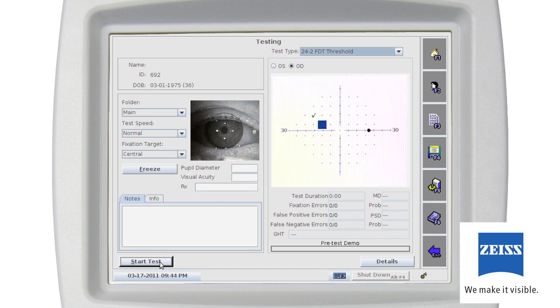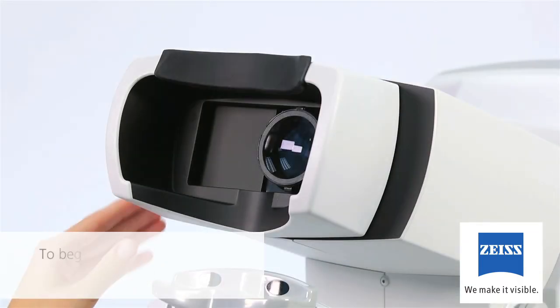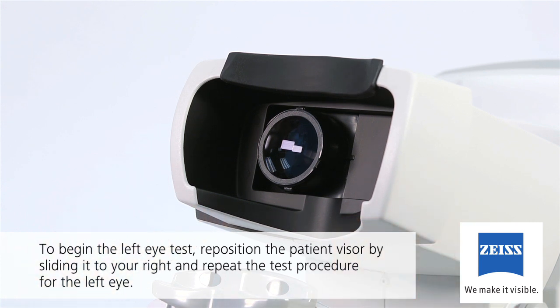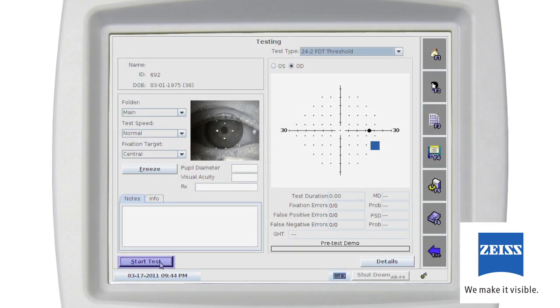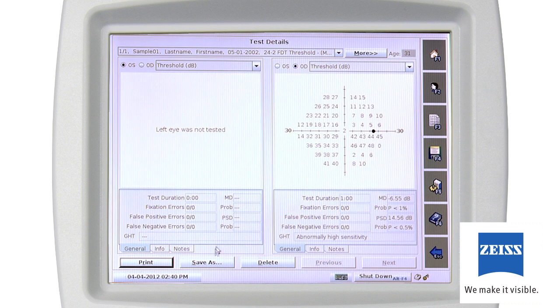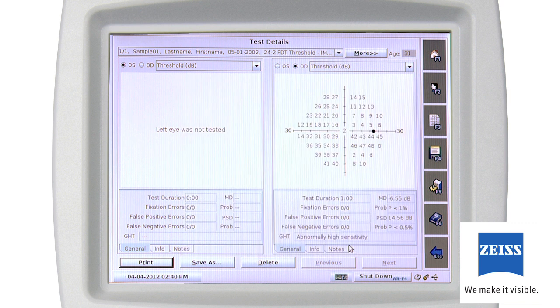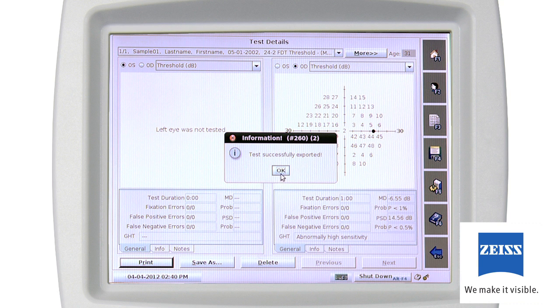You can now choose Start Left Eye, New Test, or Done Testing. Align your patient and give them the same instructions as you did for the right eye test, then click the Start Left Eye button. When the tests are completed for both eyes, results are automatically saved to the instrument's hard drive, to a USB stick, and sent to the printer. If you prefer changing the default locations for saving test results, please see the system settings section of the user manual.